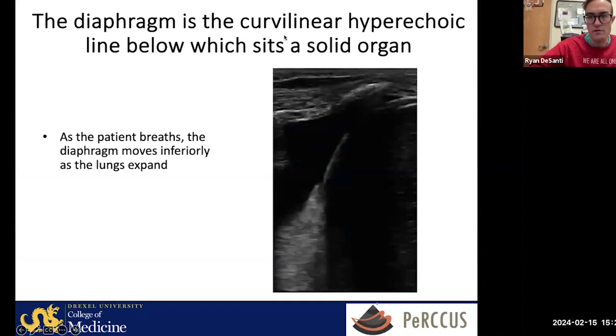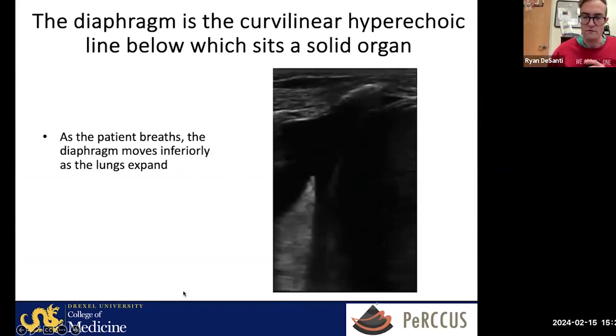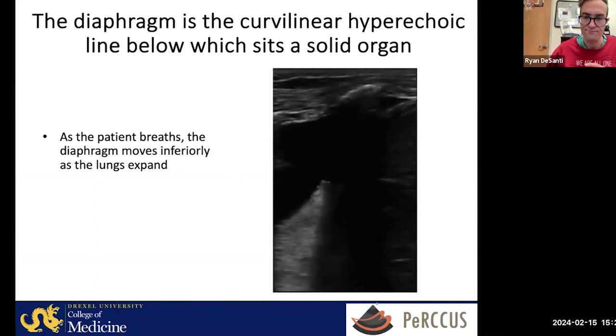So the diaphragm is a curvilinear hyperechoic line below which sits a solid organ. As the patient breathes, the diaphragm moves inferiorly as the lung expands, and is well outlined in this picture because of an effusion.